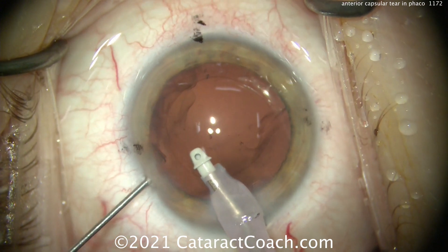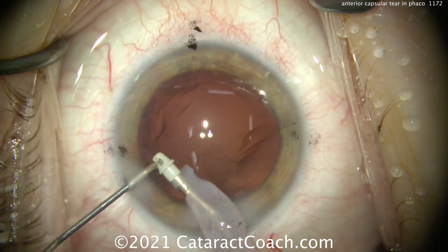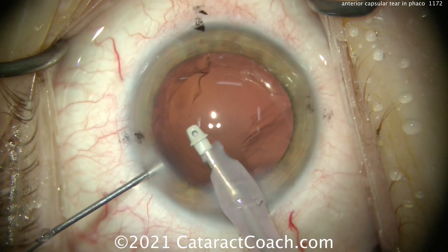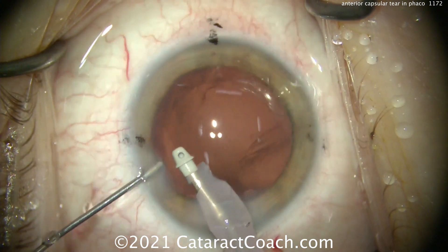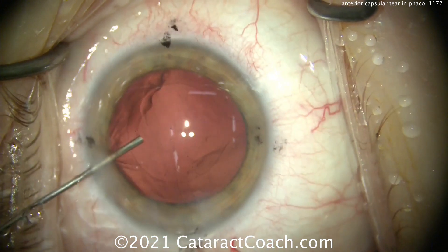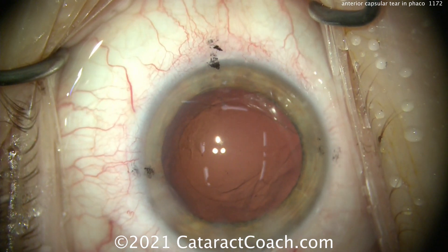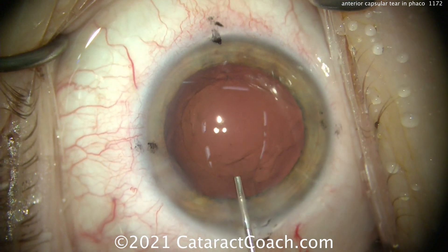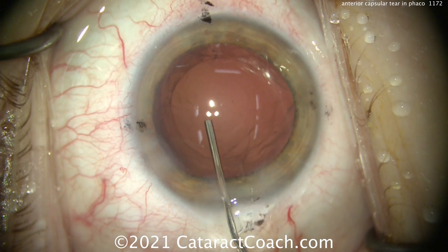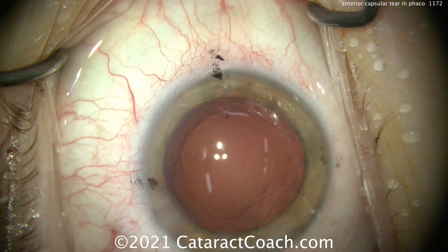So there's the rip you can see. We're going to be very cautious and not let the AC collapse. While the eye probe's on position one, taking that last little nuclear piece, we're going to put the viscoelastic in with the second hand and fill up the capsular bag. Take your foot to position zero at the same time you inject, and we don't let that AC collapse. Don't overfill it — because if you overfill it, that additional stress will cause it to rip out again. On the right-hand side of your screen, to the patient's inferior, there's the anterior capsular rip.